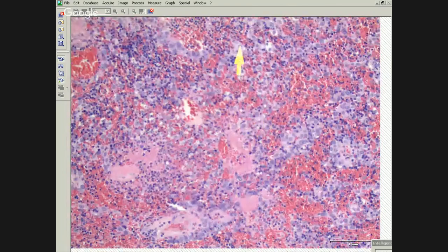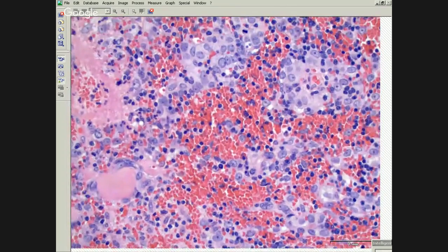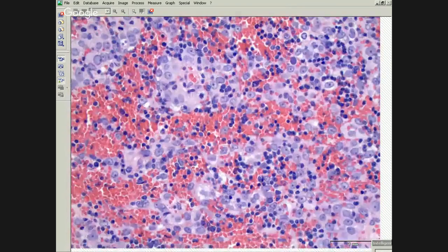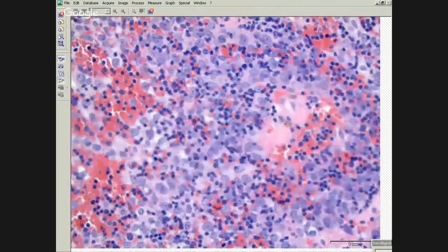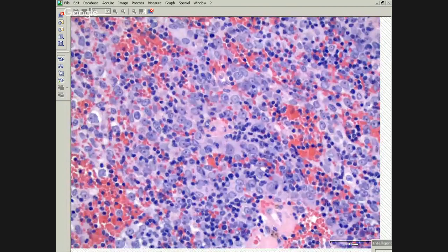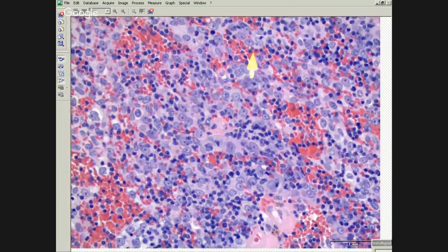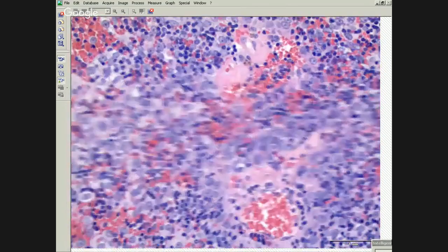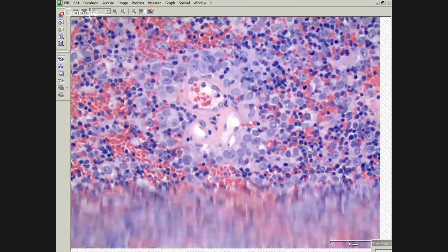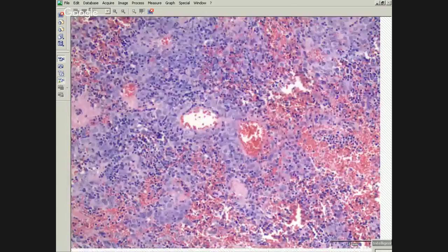Okay, so let's talk about these guys here. What do we think about them? Histiocytes, looks like. Okay, so your clinician is once again a poor historian. It can be some hematolymphoid, some hematologic thing too. So if you don't have a story on this, you can go down all sorts of different paths. It can be some histiocytic cells too, right? Like lymphoid histiocyte.